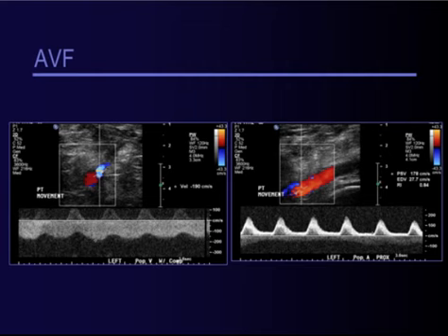Okay, one other finding here, patient with lower extremity edema. No DVT, but as the vein was being imaged, you can see that there is an arterialized flow pattern in the vein, which prompted imaging of the associated popliteal artery. This is not the normal appearance to a lower extremity arterial waveform. This is actually decreased in resistance, and the conjunction of these two findings is most compatible with an arteriovenous fistula. Sometimes the fistula may not be seen, but this high arterialized flow in the vein is enough to make the diagnosis.